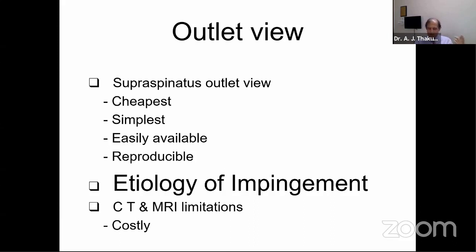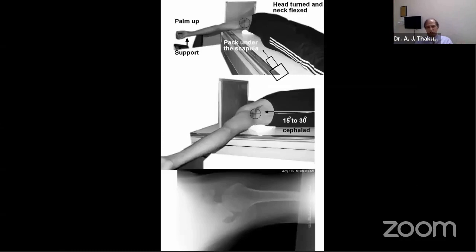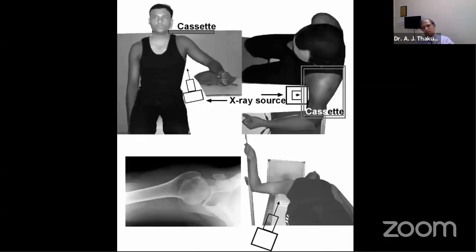MRI, CTs are good, but they are costly and they can be taken as second line of defense. Axillary view we have already seen, but as I said, it is an alternate method. That one is very painful. Patient, even with his worst hurt, can still abduct a little when supported on the side. You can then keep the X-ray machine in this gap, keep the cassette on the top, and this way one can get the lateral also without causing much discomfort. But while lateral is much better, this is the next best.